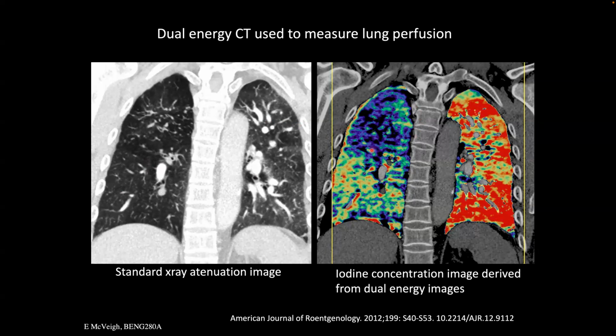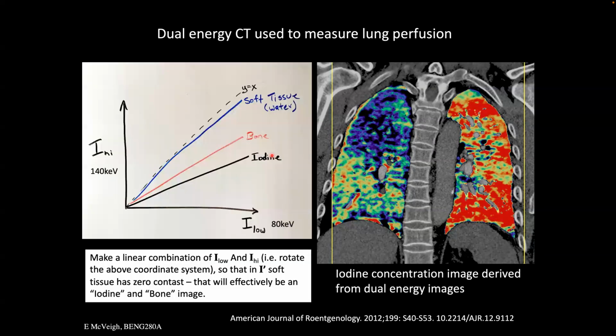And so then you would go back and say, okay, this person has some kind of thrombus upstream, and we've got to go find it, right? And I'll open that thing up. Dual energy is used to isolate the signal from iodine by looking at the change in the signal when you take a low energy, like a soft X-ray beam picture, and a high energy picture.